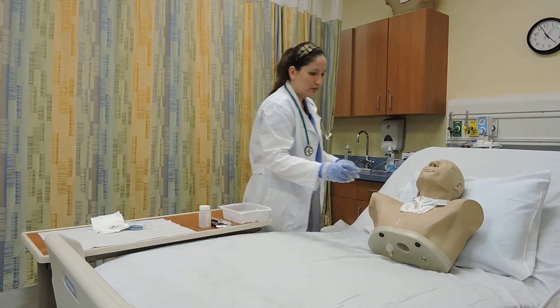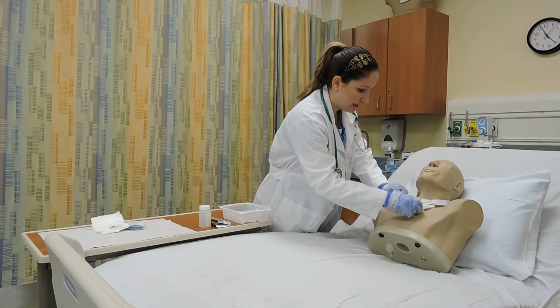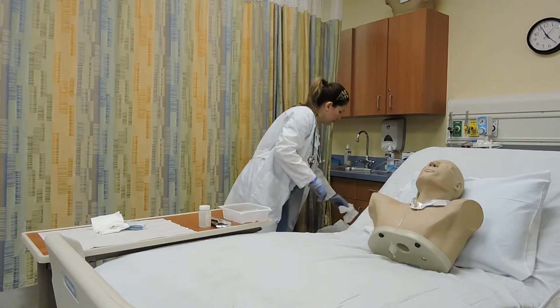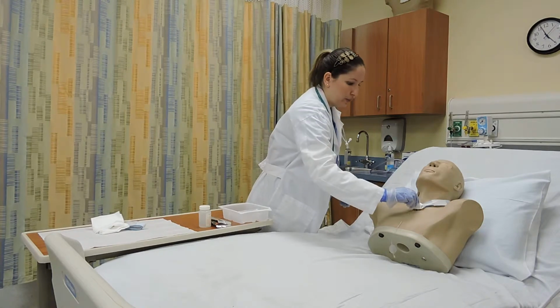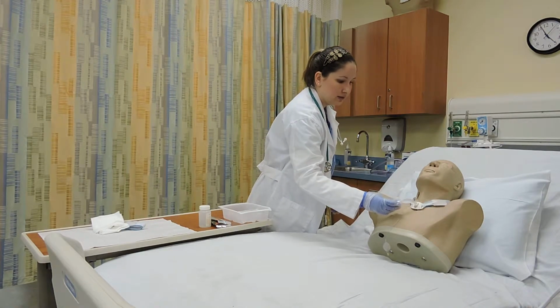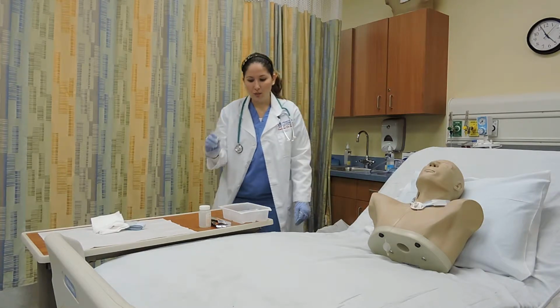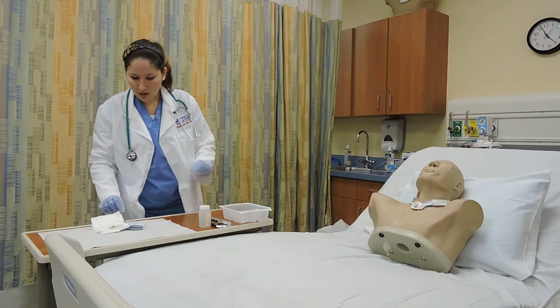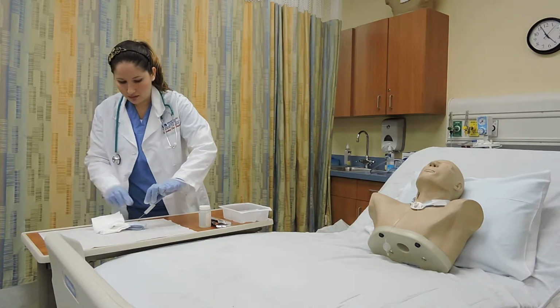First, we're going to remove this dirty pre-cut 4x4 gauze. Remove the inner cannula and let it sit in the mixture of hydrogen peroxide and sterile water for at least 15 seconds. After, we're going to grab the brush.